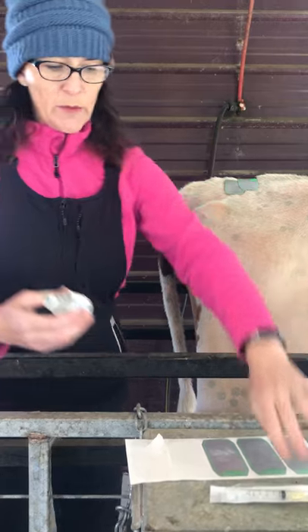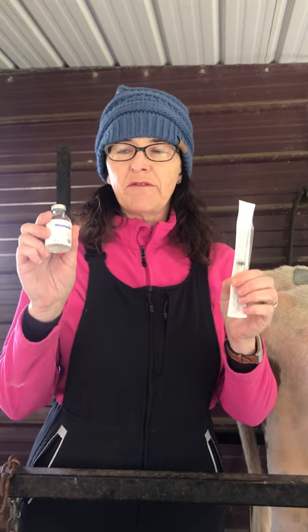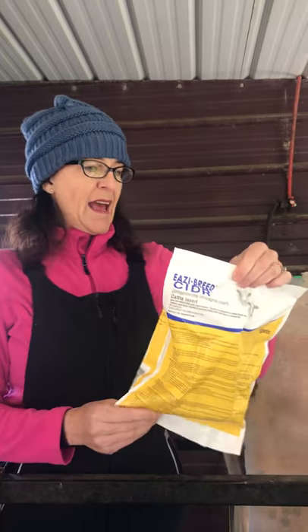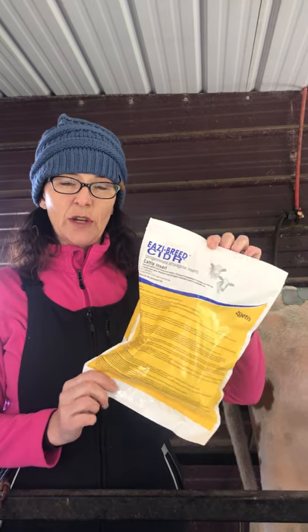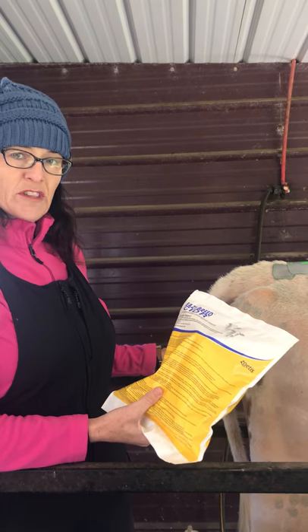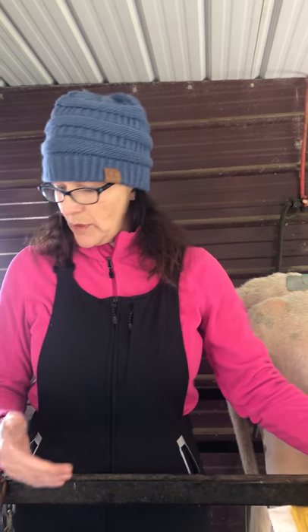So we're going to do two things. We're going to give her a shot of GnRH, which is Cystorelin, and that will cause her to ovulate any follicles she has already. Then we're going to put in an Easy-Breed CIDR, which is a progesterone implant that we put in her vagina. It will stay there for seven days, and when we pull it out we'll give her another luteolytic shot, which will make her go ahead and start her heat cycle, and then we'll know exactly when to breed her.